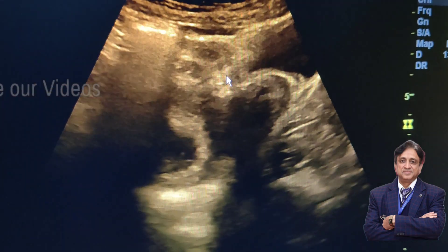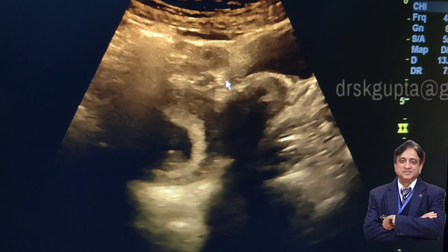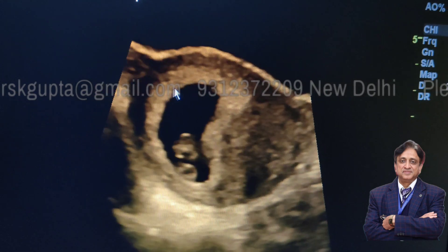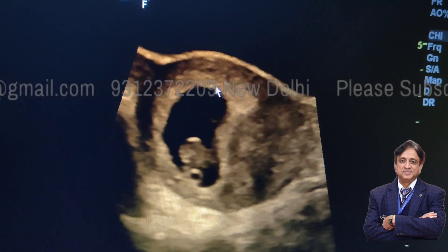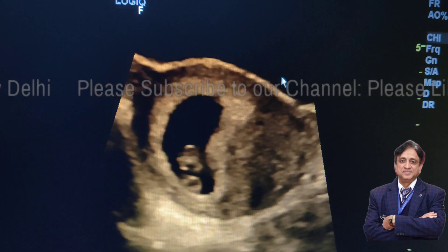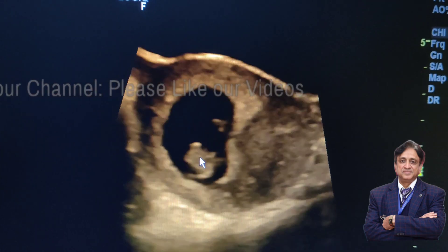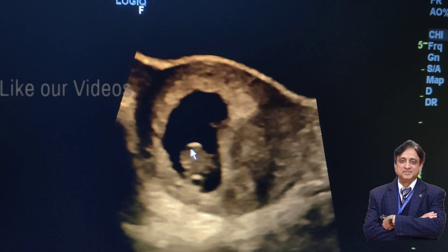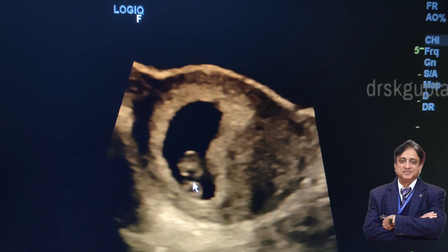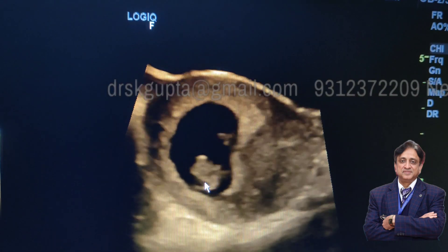So ask the patient to wait, and let us see how the uterus appears once the patient has a full bladder. And this is the beautiful gestational sac which is very well seen because the bladder is now full. Inside the gestational sac you can see there is a fetal pole, and just adjacent to the fetal pole you can see there is a spherical structure.